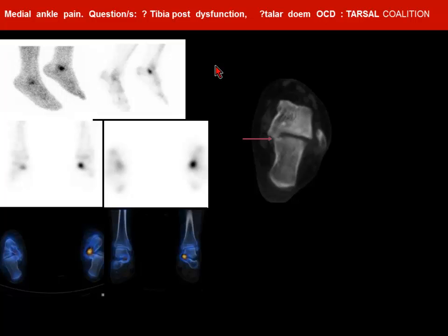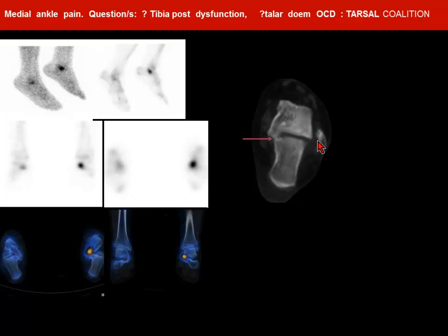That is a classical area. However, sometimes the focal uptake may be on the opposite side because the patient is placing considerable biomechanical stress on the medial aspect rather than the lateral aspect. If you go purely by radiological imaging you can make a misdiagnosis. In this case the focal uptake was on the medial aspect, so all the patient required was a local steroid injection in that area, and the patient became asymptomatic. If you had gone purely on the CT findings the orthopaedic surgeon would have treated the wrong area rather than where the pain generator actually is.